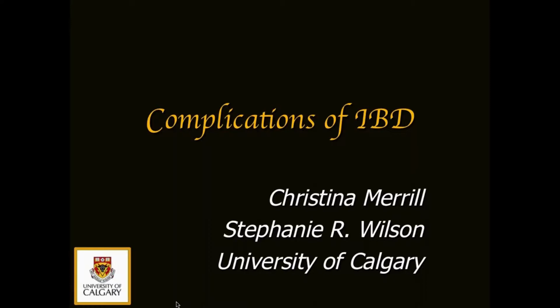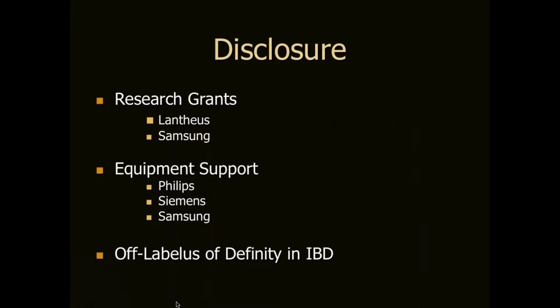And I hope that I will share with you my experience, that this is a really excellent tool, that the patients that are at diagnosis, at surveillance, or with acute presentation all can benefit for complication detection with ultrasound, and it is not necessary to go to either CT or MR scan to show these complications. So these are my research grants and equipment support, and the description of DEFINITY in inflammatory bowel disease is off-label.